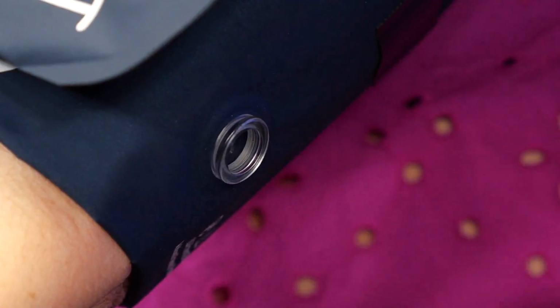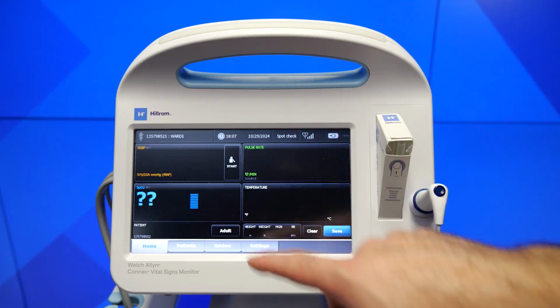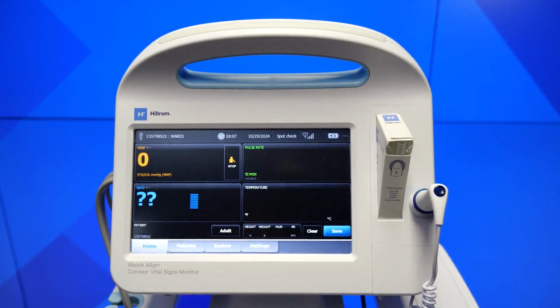Snap the fitting from your blood pressure device directly into the cuff and wait for the click sound. Once the patient is fully situated and the cuff is applied, press the Start button on the NIBP tile to initiate a singular reading. The cuff will inflate with the SureBP algorithm and capture a measurement on inflation. If the device detects motion or artifact, it may default to step deflation in an effort to obtain a reading.